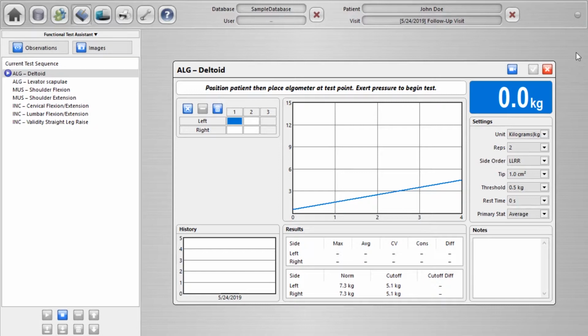That's one of the big benefits of being able to objectify data points like that, even with something like pain, which is traditionally, even at best, poking the person and saying, well, did that hurt? Well, yes or no. We now actually are able to tie an actual numeric value to that point, and identify the point at which that patient observably, by their reckoning, reaches the minimum point of pain or of discomfort. So that allows us also to compare to population normals.